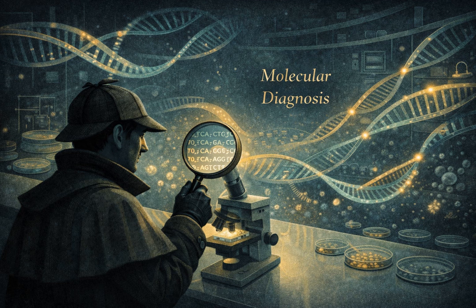But what makes this one gene so special for identification? It's the structure of the gene itself. It has some regions that are conserved, meaning the DNA sequence is identical or nearly identical in almost every bacteria on the planet. That's handy. Gives you a universal landing pad for your primers, right? Exactly. You can design a set of universal primers that will bind to and amplify the 16S gene from any bacteria you happen to find. But, and this is the key, in between those conserved regions, there are 9 hypervariable regions. These are unique to the species, or at least the genus. The sequence of A's, T's, C's, and G's in those variable regions is like a fingerprint.